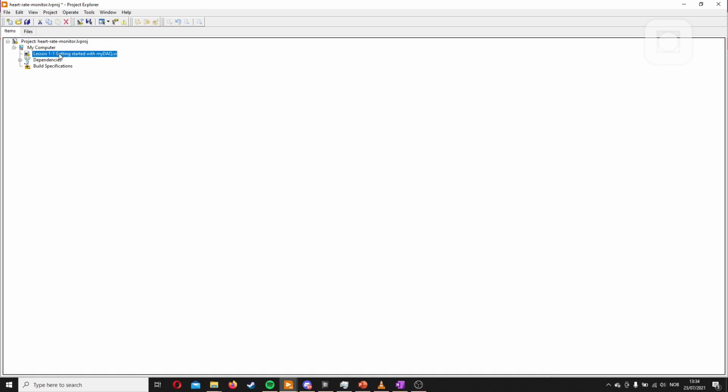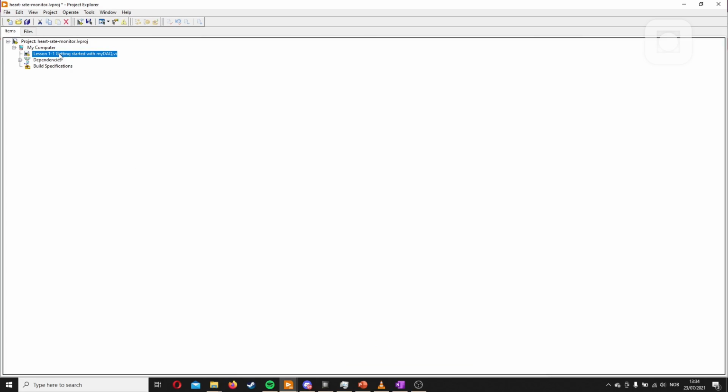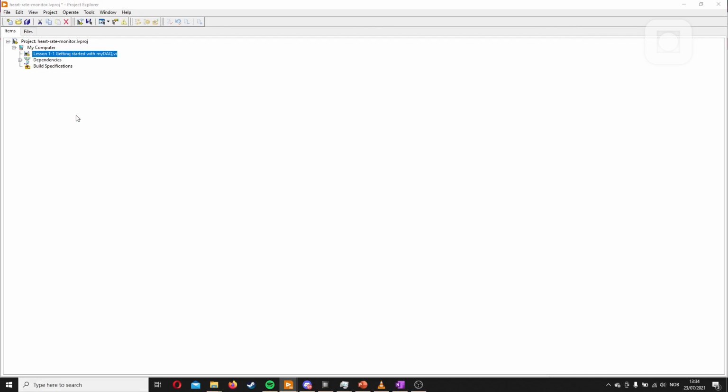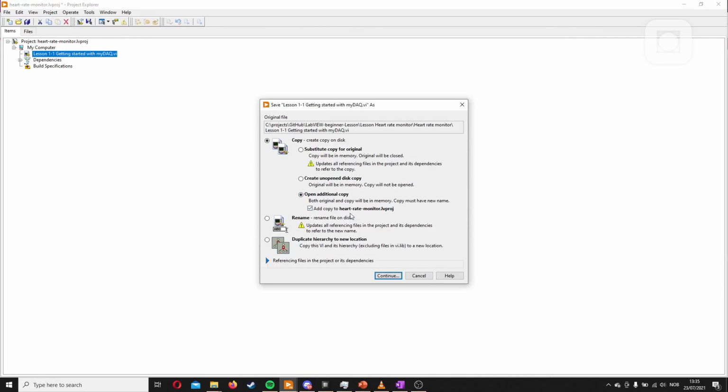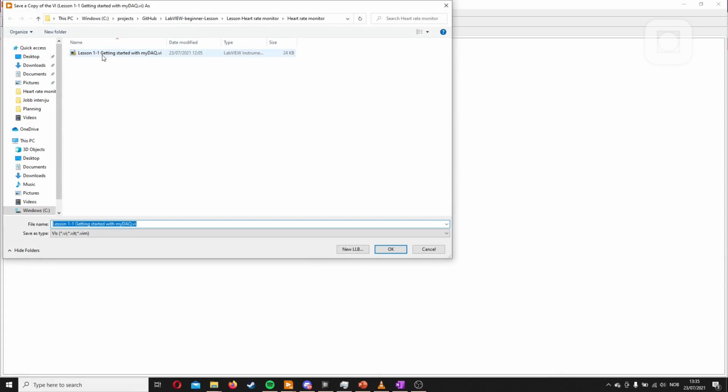First thing we need to do before we can copy it is to open it. And then we take Save As, open an additional copy, add copy to the project. And we'll just click this once, just so you get some parts of the name. And we'll just start from there. So 2, that's it. Compartmentalizing the acquisition. We'll just call it after lesson names for now.